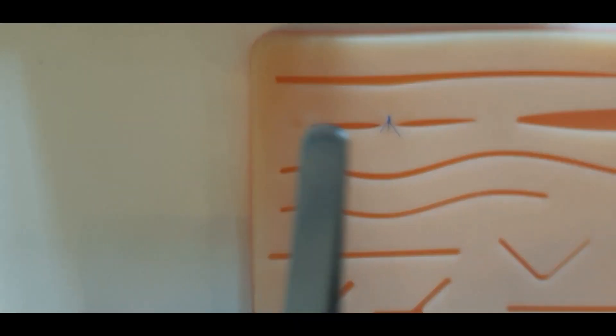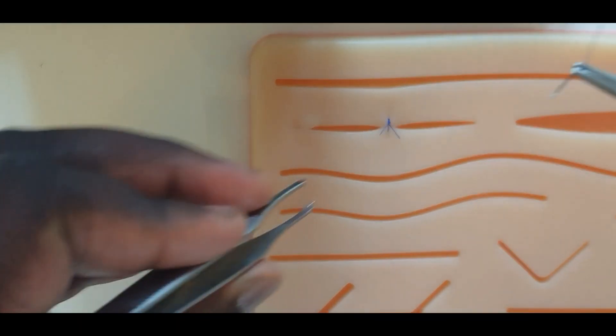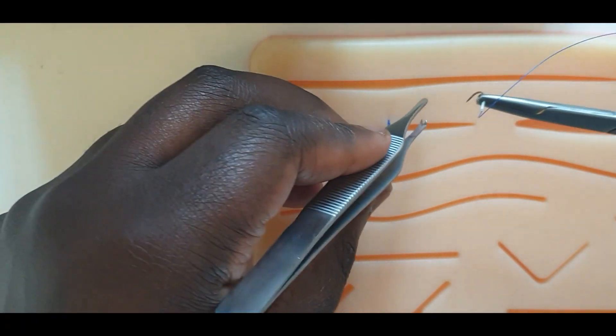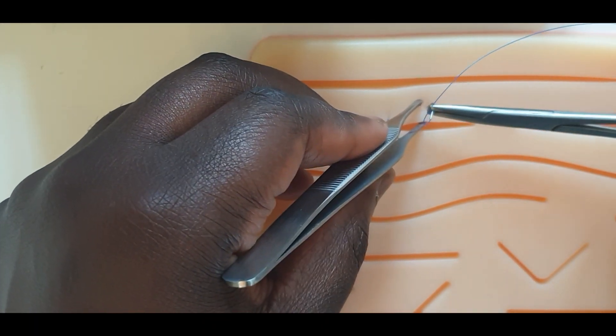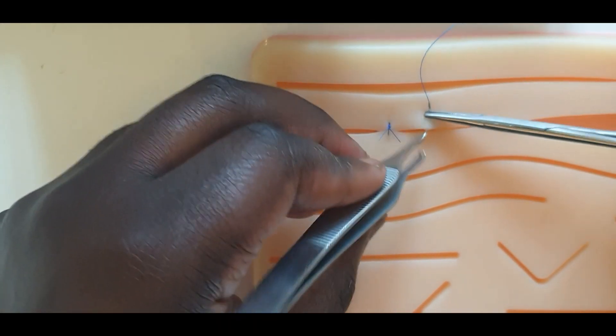Where wounds have distracting forces of tension, such that your initial surgeon's knot will not hold, another technique to avoid this initial knot loosening is to slip the knot.